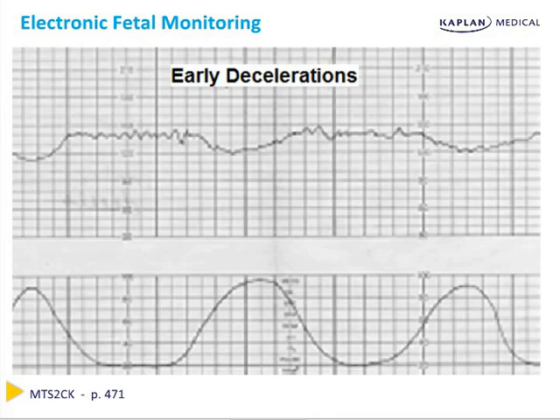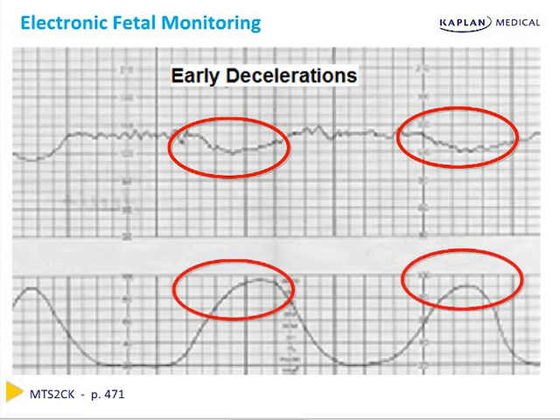You may be shown different types of fetal heart tracings on the Step 2 exam and be expected to know what to do next as the next step in management or understand the physiologic process behind the deceleration. We'll review the classic ones here. Early decelerations occur with the onset of contractions and resolve afterwards. Again, these are due to a vagal reaction as a result of compression of the fetal head during contraction.